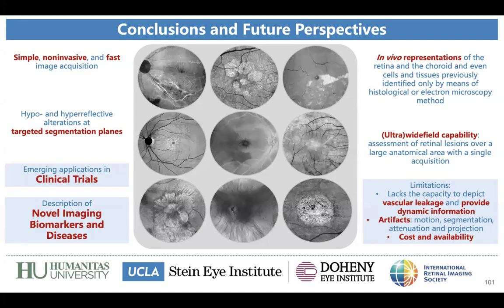Also, we have discussed the artifacts and the limitations of each method and the need for a comprehensive interpretation of the images. Yeah. In the paper, you mentioned that we presented the blue light reflectance imaging. We found very useful information from a no-cost method.